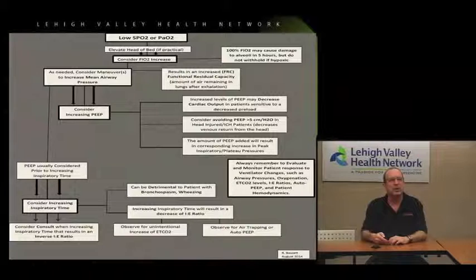We started with our low pulse ox, or maybe our low arterial blood gas oxygenation. This might be a little bit hard to see, and probably of more value if you have it right in front of you. It is on EMS charts right now, and like I said, it's going to be in one of our resources.